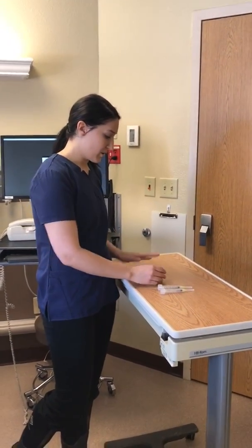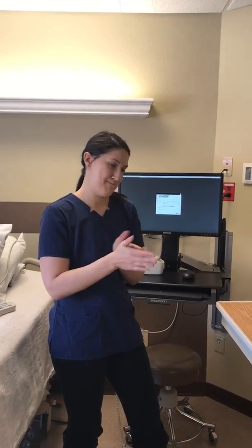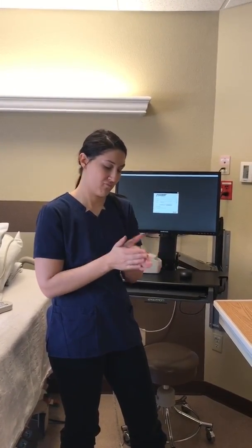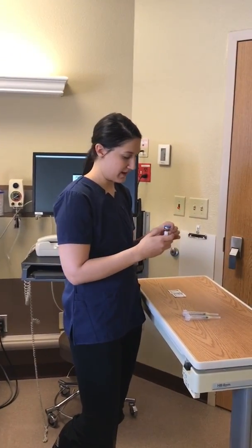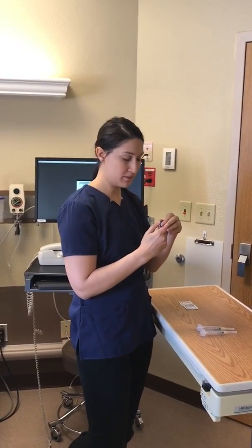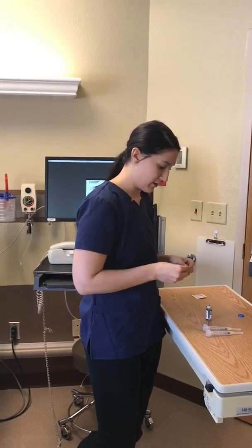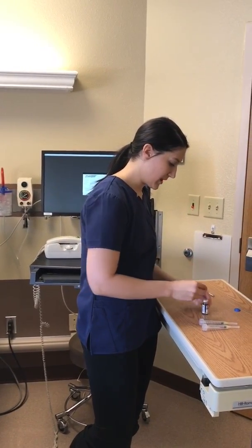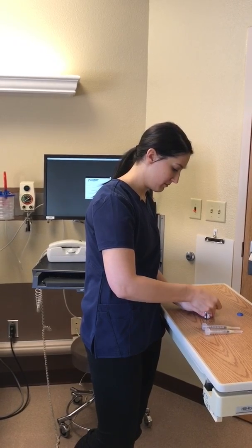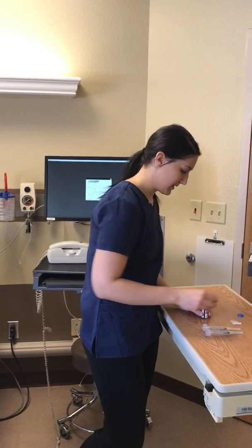The next thing I'm going to go ahead and do is roll the vial in between my hands to mix that up. Okay. Perfect. So I'm going to go ahead and pop the top off of this vial. And I'm going to take my alcohol pad, and I'm going to clean the top of the vial. And then that is going to go ahead and be my sterile surface.